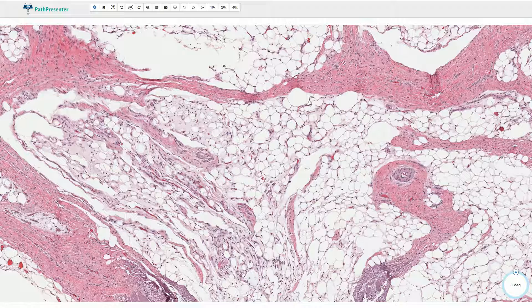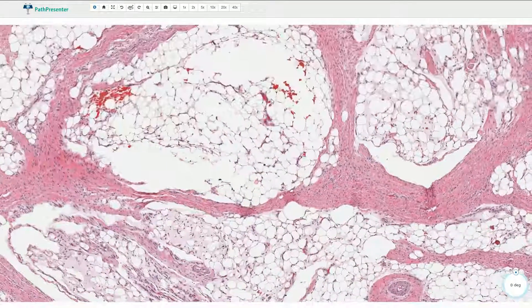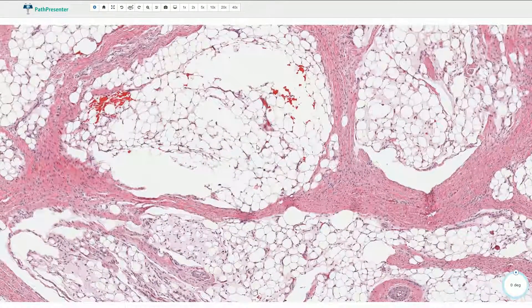On the other hand, lipoblastoma is associated with so-called zonation: we see areas of mature adipocytes and areas or zones of myxoid appearance, and these zones are not mixed together.